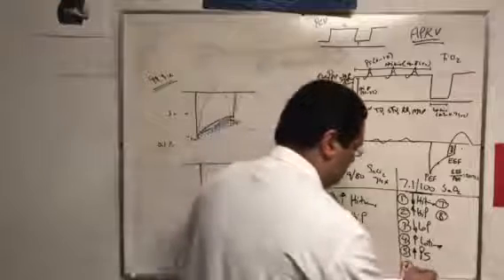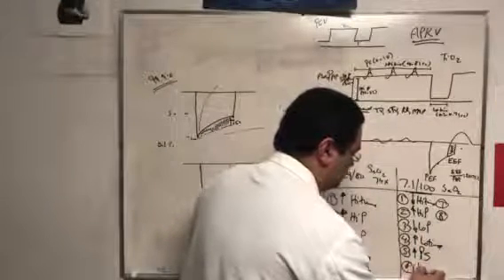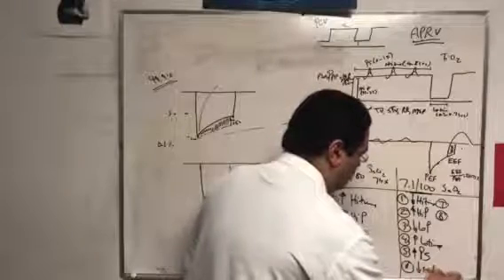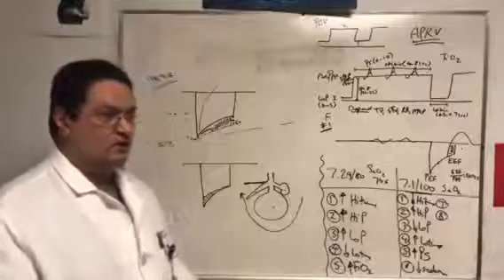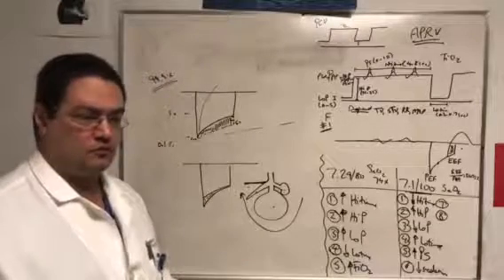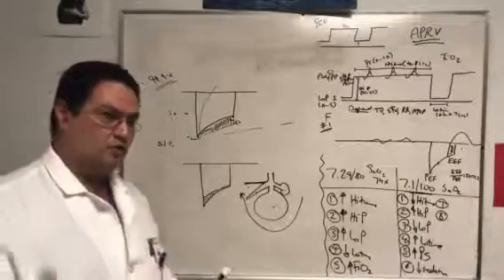All right. Last one. I mean, we have a couple here. Decrease sedation. So what happens in a pressure control or volume control mode when we say the patient is doing badly? We sedate them more. Doing worse, we paralyze them. You know, we take over, with a controlled mode of ventilation.